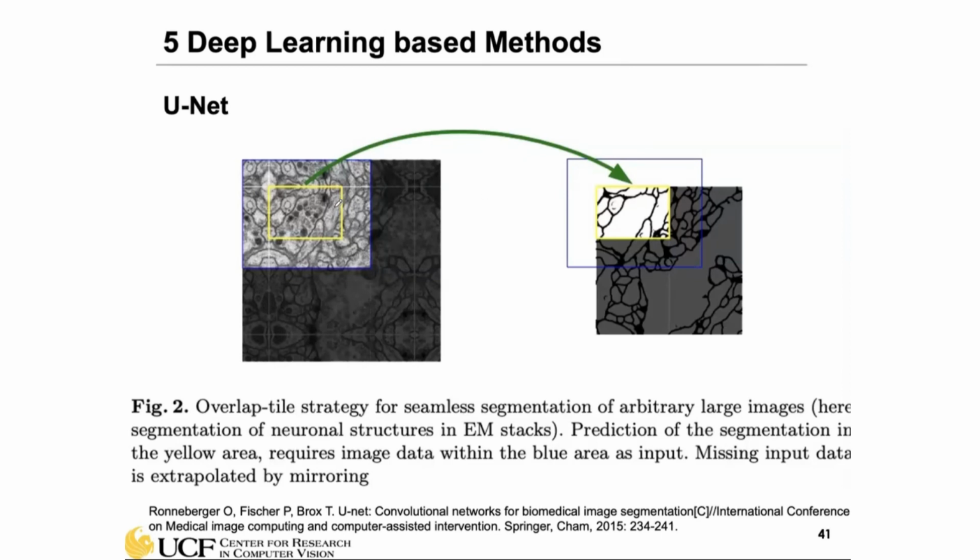But resizing could change some of the information, right? If you resize a small image to a larger one, you introduce some noise. But if you have a larger resolution and reduce it, you lose a lot of information. So we don't want to manually introduce this kind of noise due to pre-processing.